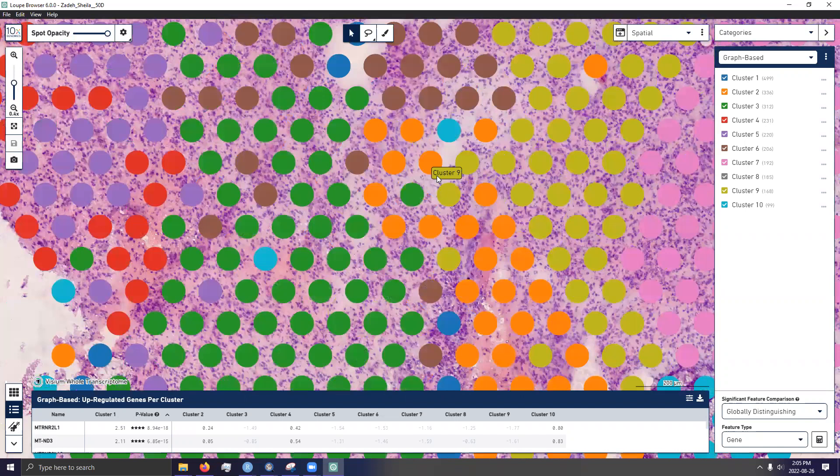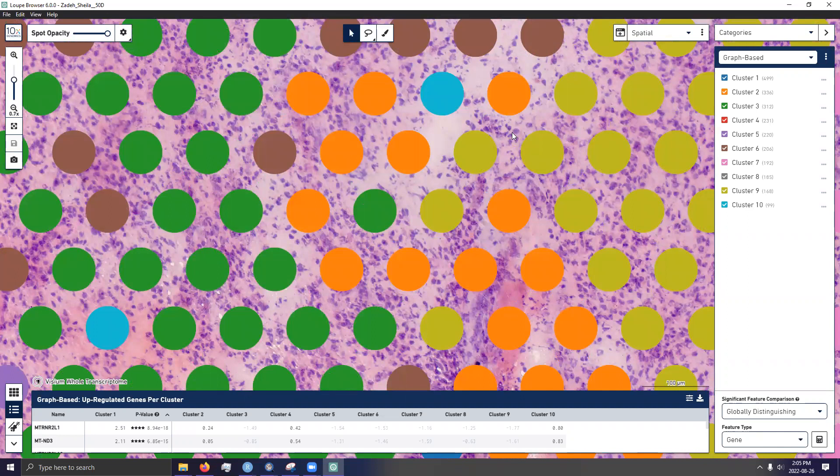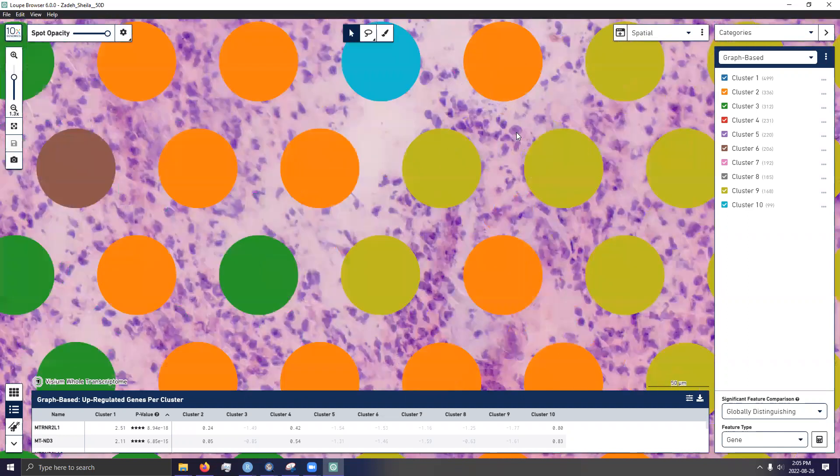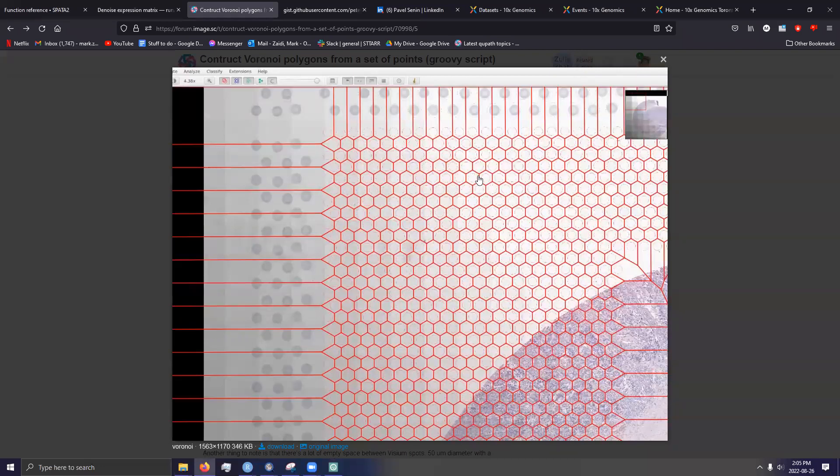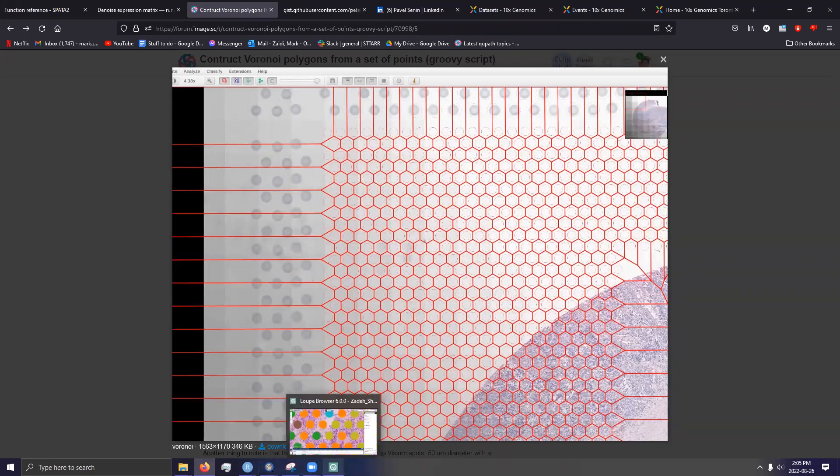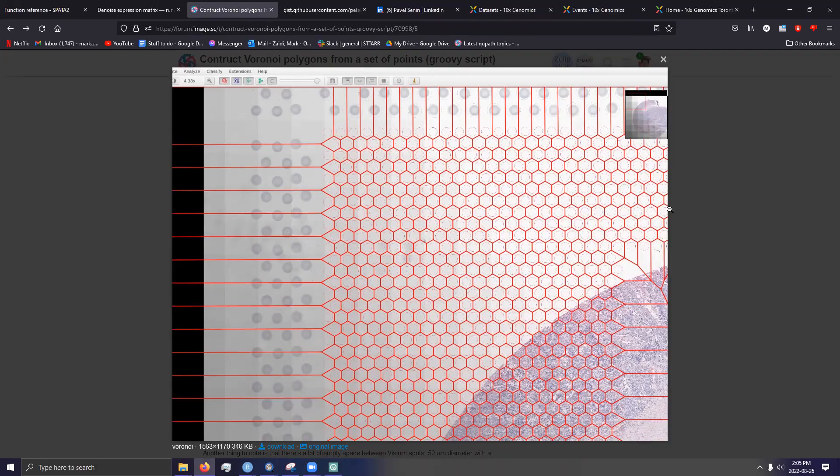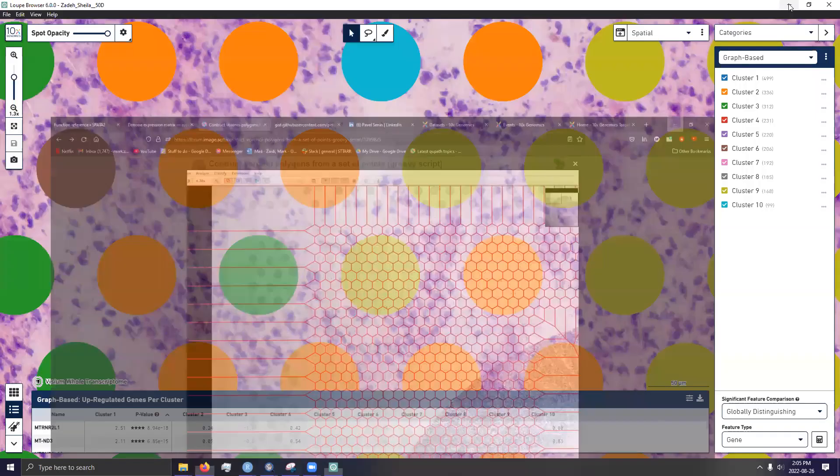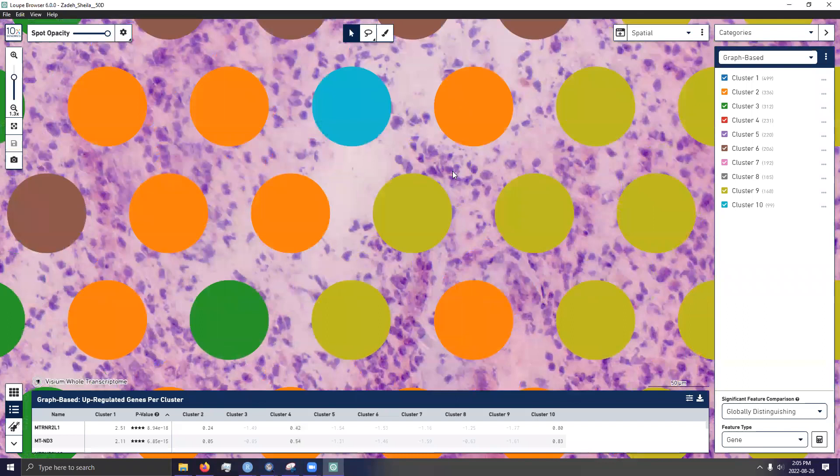Meaning you can't, or you shouldn't necessarily use a Voronoi tessellation to infer whether or not a cell will land in the spot. Because as you can clearly see, there are a lot of cells that will lie outside of a spot. And consequently, its genetic information, or rather transcriptomic information, may or may not be incorporated into individual spot itself.